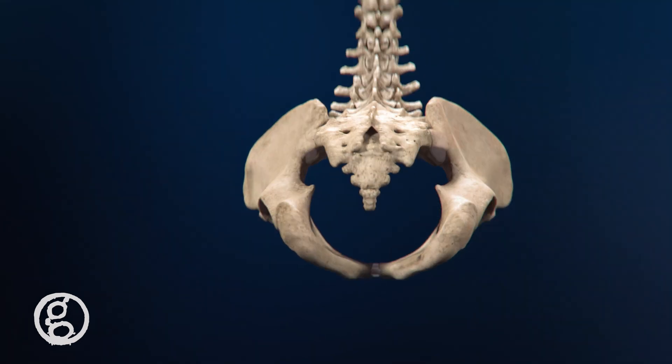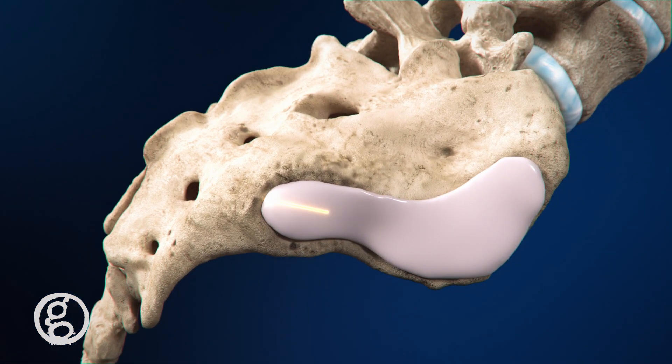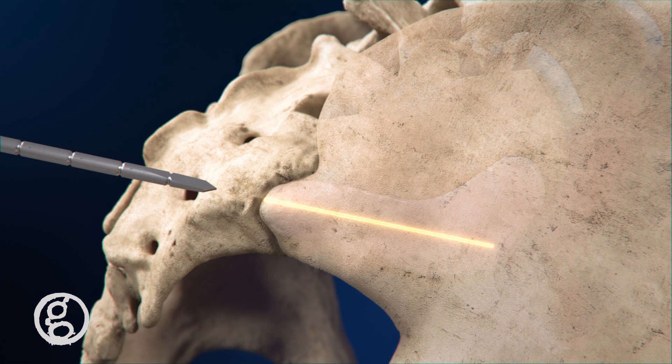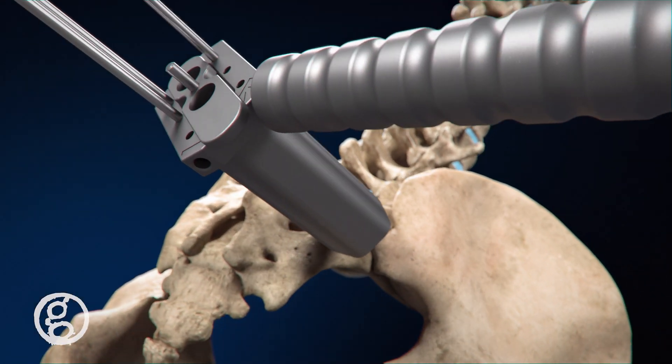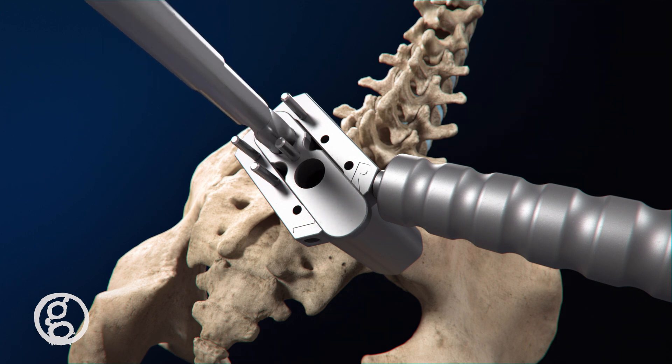The Catamaran procedure uses an inferior posterior approach where a graduated guide wire is placed along the articular portion of the SI joint, establishing the trajectory. K-wires secure the access sleeve and drill guide to the sacrum as the first pontoon channel is drilled.